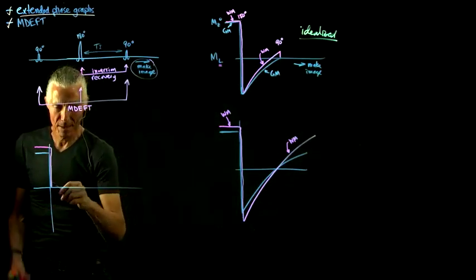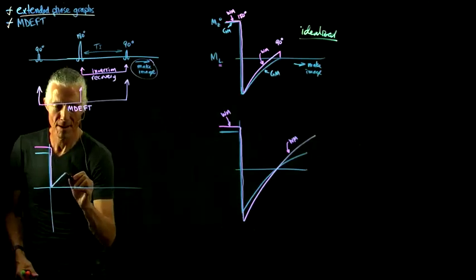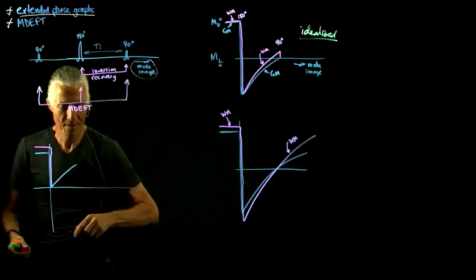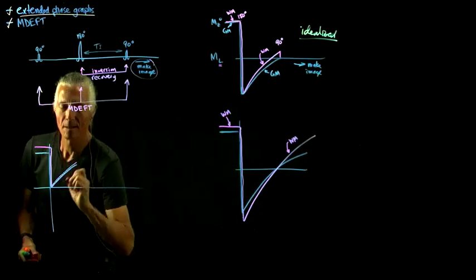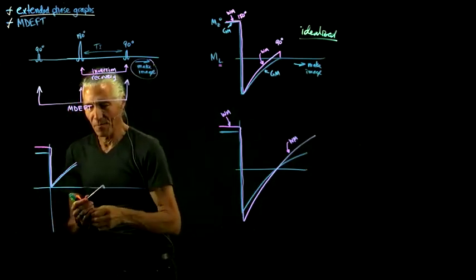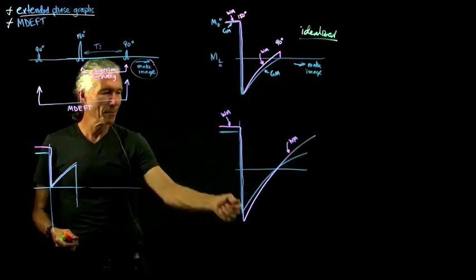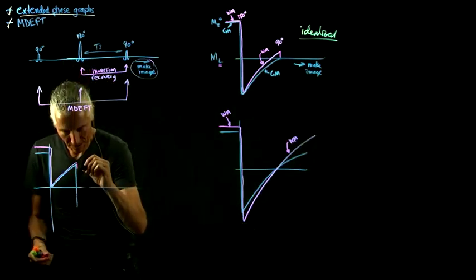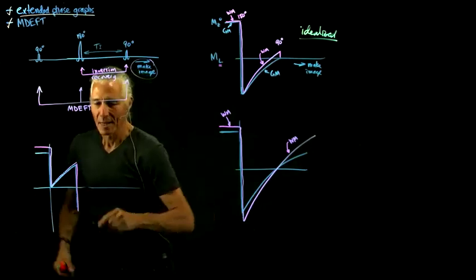And so then what will happen is the gray matter will start recovering, not quite as quick, and the white matter will recover a little quicker. And then when we do our flip, we'll have less of a difference than we would in this case. So now we'll still have a difference, so this guy's still going to go down further, but there'll be less of a difference.